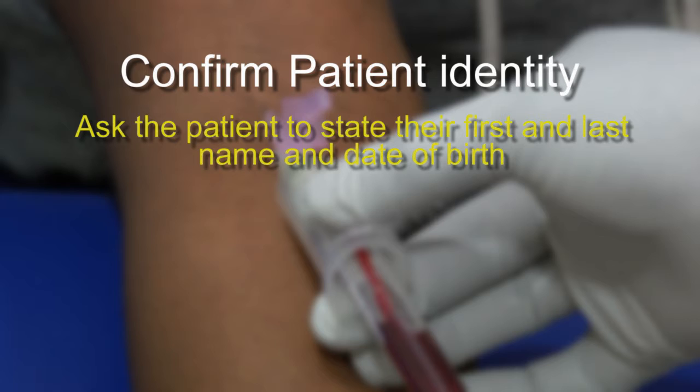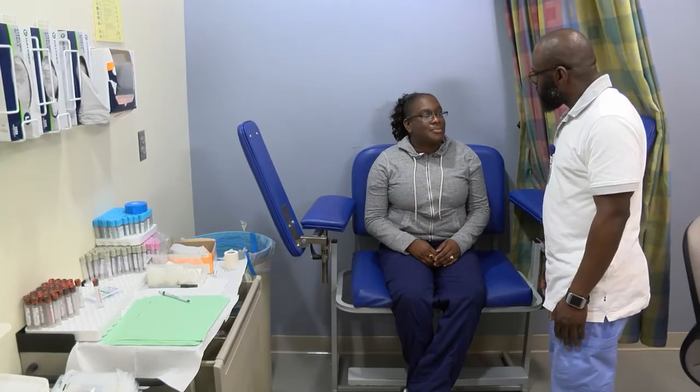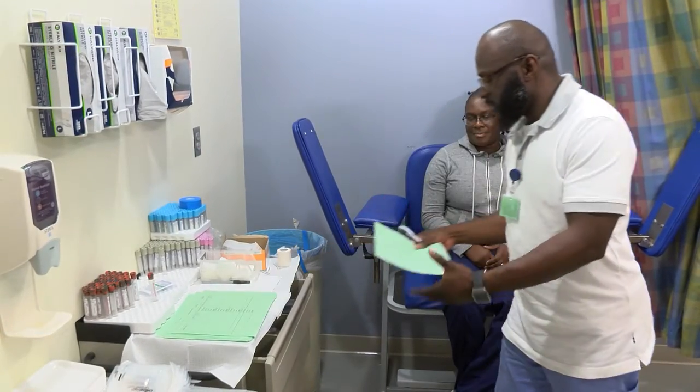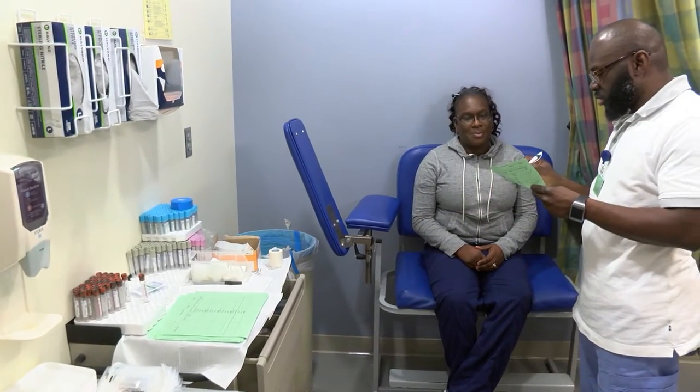Confirm the identity of the patient. Once you have greeted the patient, ask the patient to say their first and last name and date of birth. Can you please repeat your name and your birth date for me, please? Jane Doe, 6/18/76. 6/18/76. Okay.